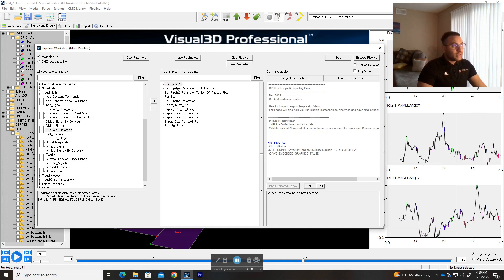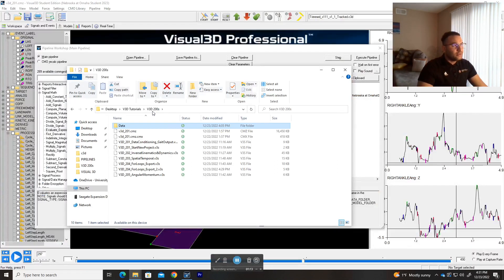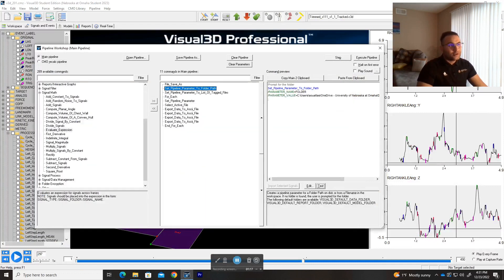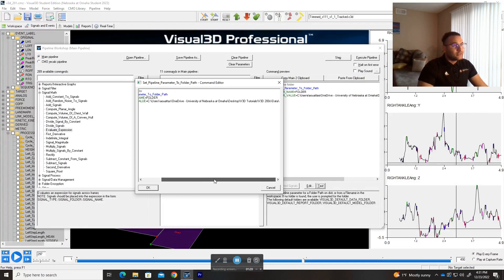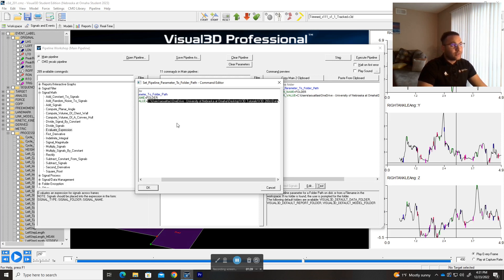The first thing you need to do is use the command 'set pipeline parameter to folder path'. The reason we choose this is because we don't want to always call the whole path — we just want to call the folder name. Choose any path you want; I chose the Desktop. Also add a slash at the end so you don't need to add it later on.